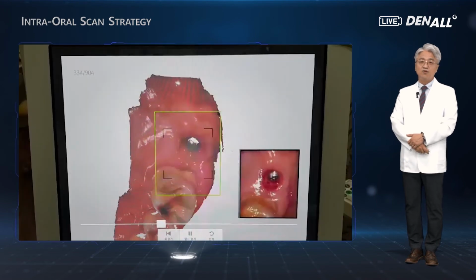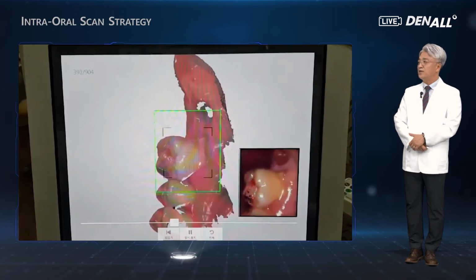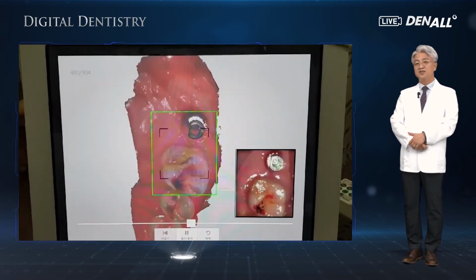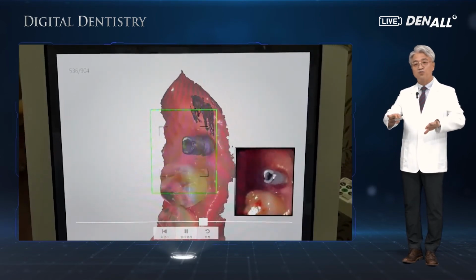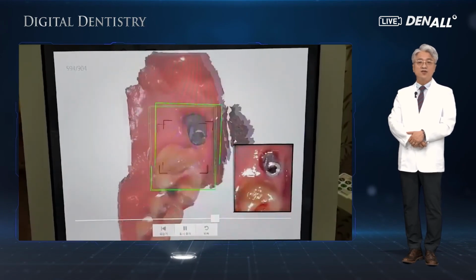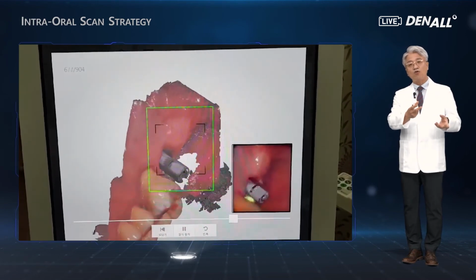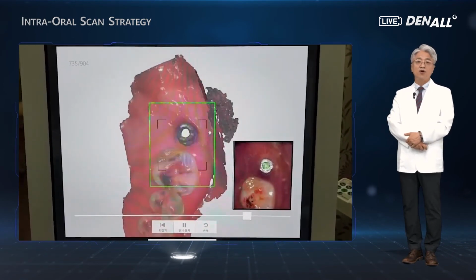Lastly, let's look at an implant case. There's one benefit in implant scanning. In the past, we used to pick up an impression, that was all. But before inserting the scan bodies, the emergence profile is scanned first, and then insert the scan bodies to scan. Then the lab analog locations are registered digitally in the model. So impression taking with the scanner is very simple.